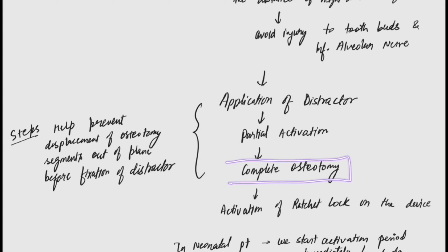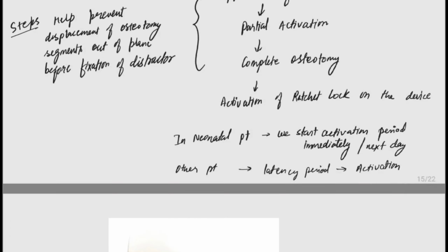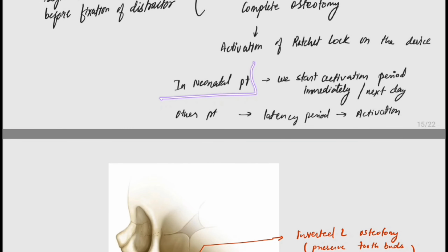And after complete osteotomy, we go for the activation of the ratchet lock on the device. In a neonatal patient, we can directly start the activation phase. There is no need for a latent period. But in other patients, we wait for the latency period followed by activation.